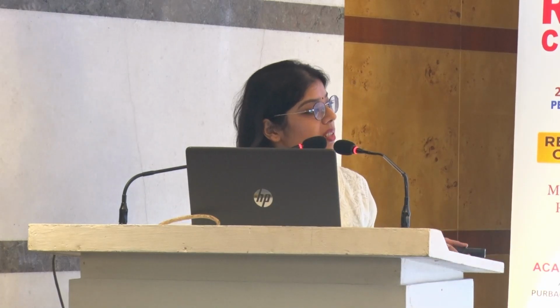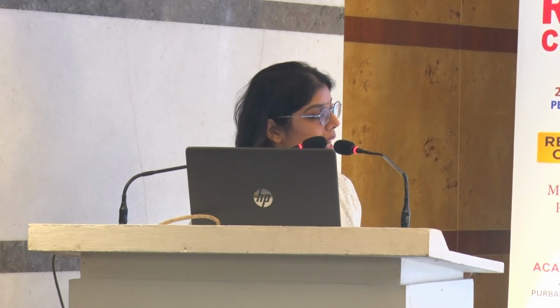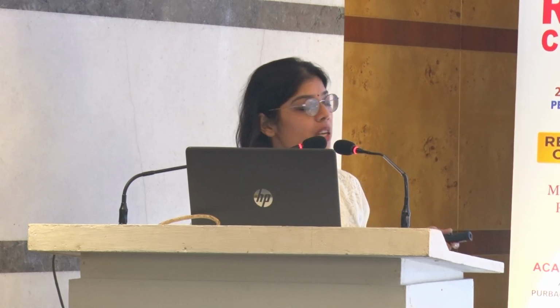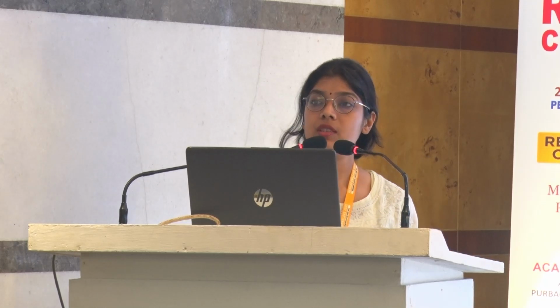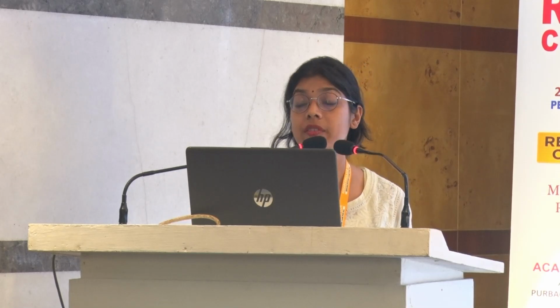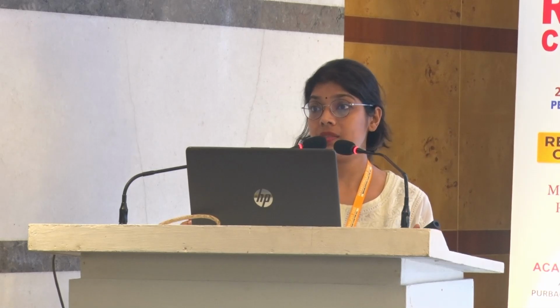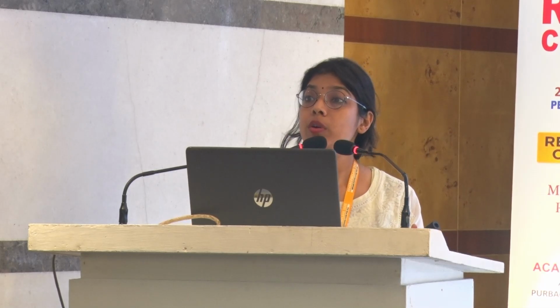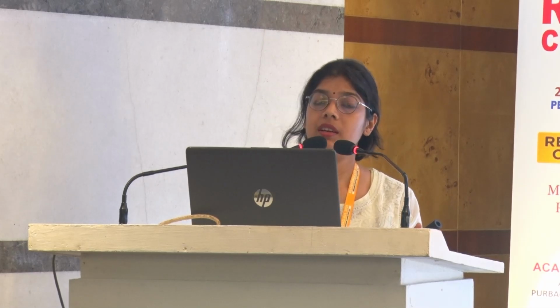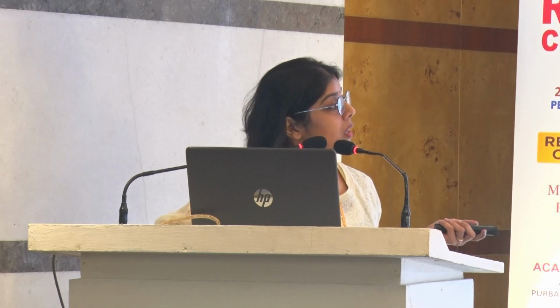Sometimes it is difficult to differentiate whether the hypoechoic area around a joint is fluid or synovial proliferation. A few things help us to differentiate. First of all is compressibility. If it is fluid, it will be compressible. If it's synovium, it will be non-compressible. Synovium might take up a few Doppler signals. Fluid will never take a Doppler signal. And fluid will be displaceable, which is why it is compressible. Also, fluid is definitely more hypoechoic, and there might be echogenic areas in a synovium.